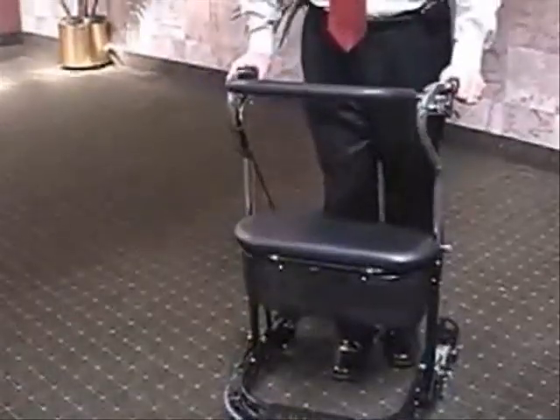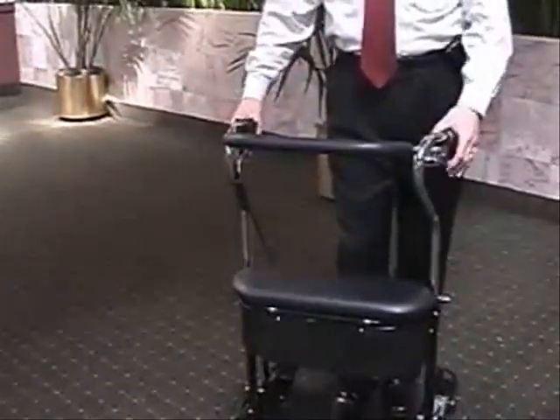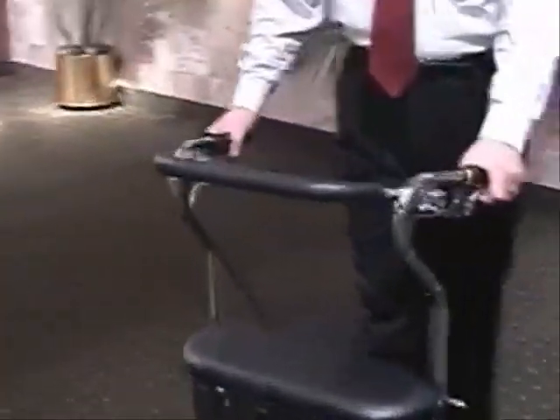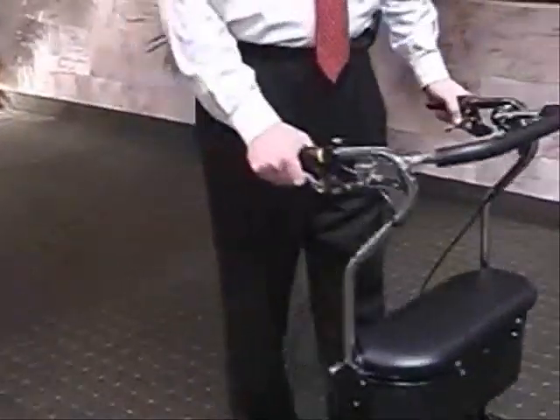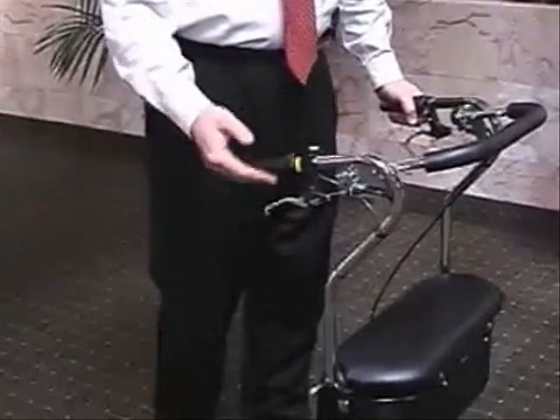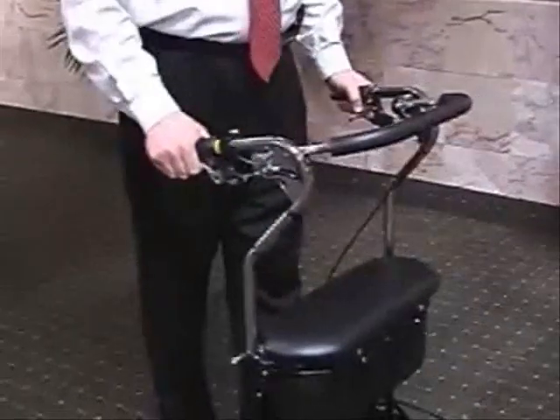What's also nice about the U-Step is the way the brakes are set up. This unit doesn't roll until you actually squeeze one of the handbrakes. You can squeeze the left handbrake or the right handbrake so it goes, and when you let go, it stops.